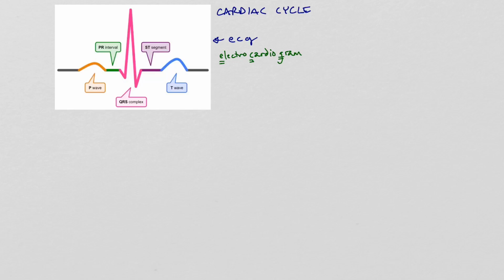Okay. All right, so let's draw in our notes this little picture here where we're going to have a straight line, a little bit of a peak, a little bit of a flat line, then a drop, increase, below drop, and then come back up, and then boom. So this part right here should be a little higher than this part right here. And this part should be kind of thin, but go really high. Let's label these different things.